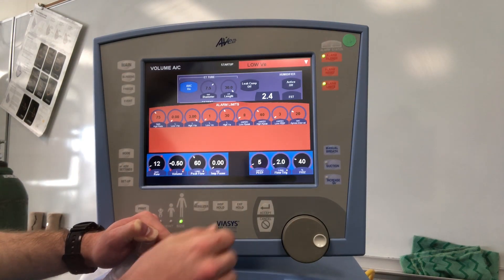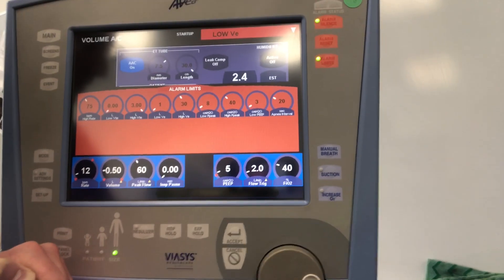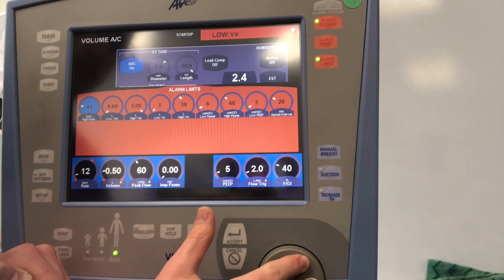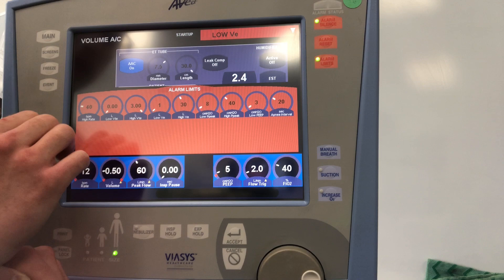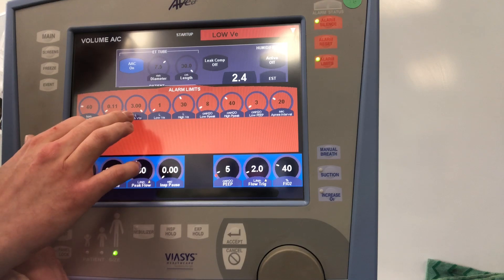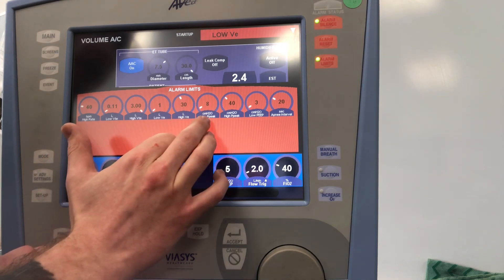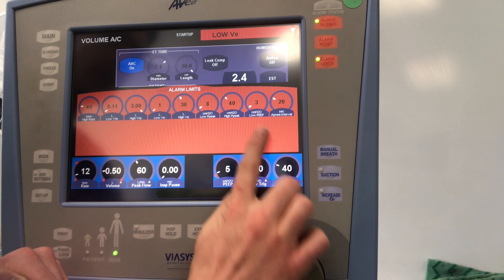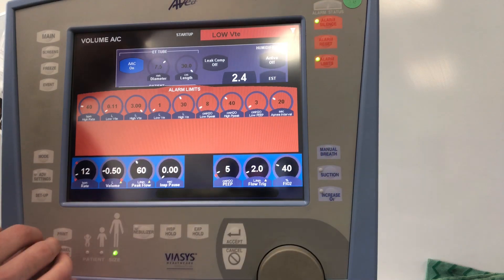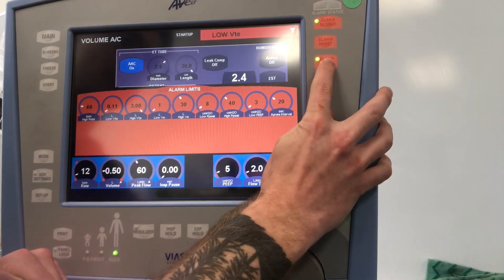We can go to alarm limits to set our alarm criteria. On the top left we have high rate — 40 is usually a good starting number. We also have low tidal volume, high tidal volume, low minute ventilation, high minute ventilation, low peak pressure, high peak pressure, low PEEP, and finally the apnea interval. If the patient has been apneic in whatever mode you're in, that's your apnea time — currently set at 20 seconds.